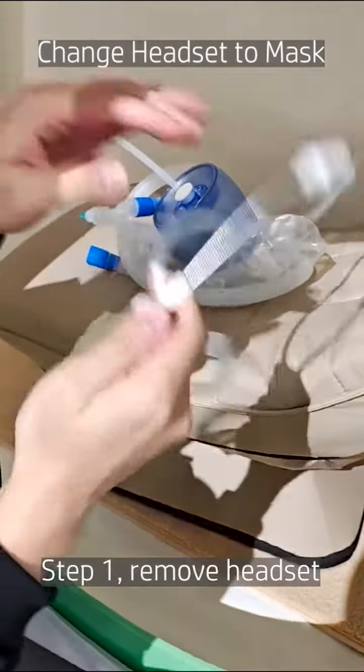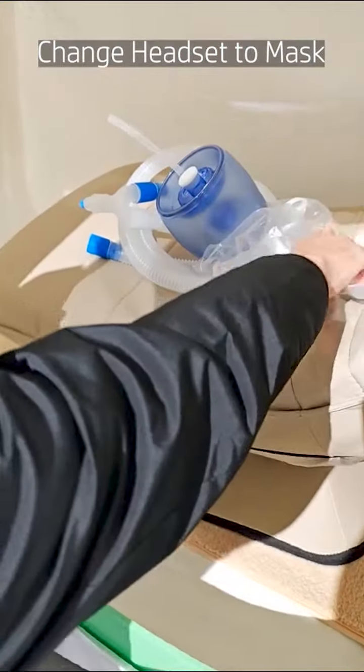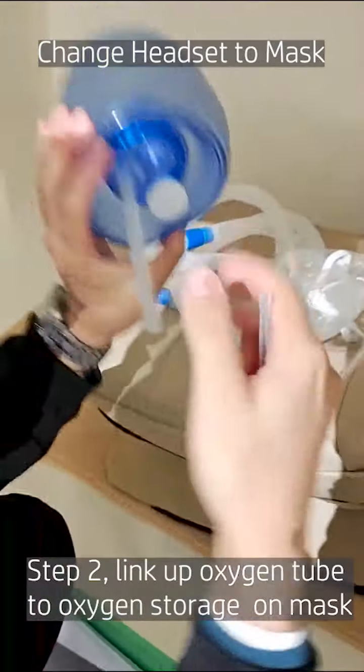Step 1. Remove headset. Step 2. Link up oxygen tube to oxygen storage on the mask.